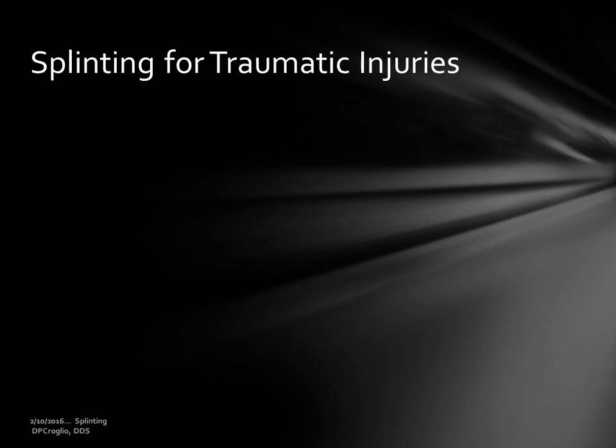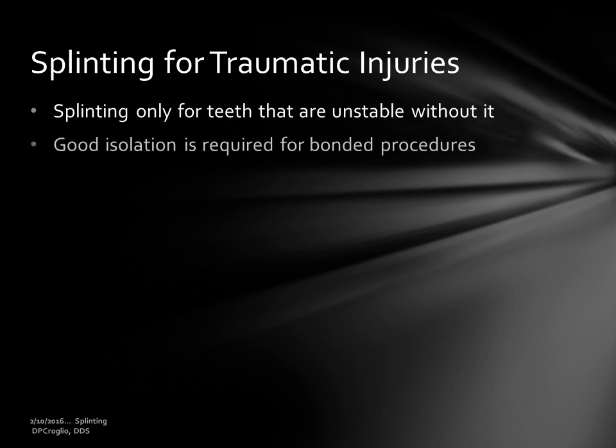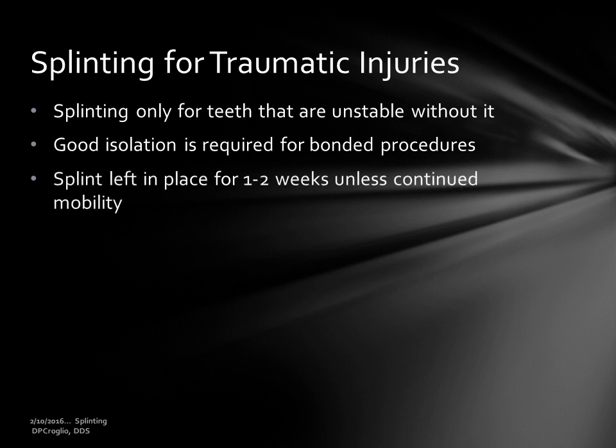Let's review some key points regarding splinting. Splinting is not always required for repair of damaged tissues, but should be used when it is required to prevent further injury to the tooth, to secure the tooth in the socket, and when needed for patient comfort. Since we are using adhesive dentistry, the field must be well isolated. Splints are generally left in place for 7 days, unless there is significant mobility or if the patient discomfort calls for leaving the splint in place longer.